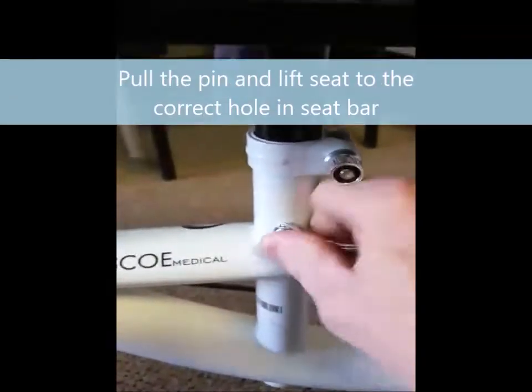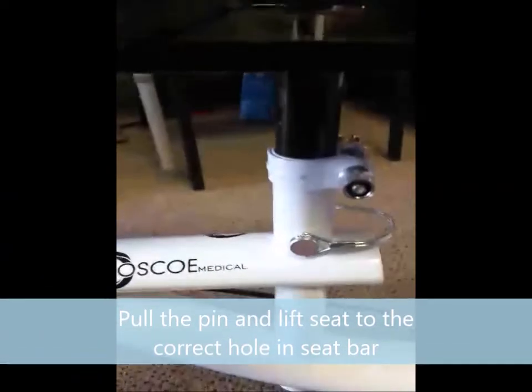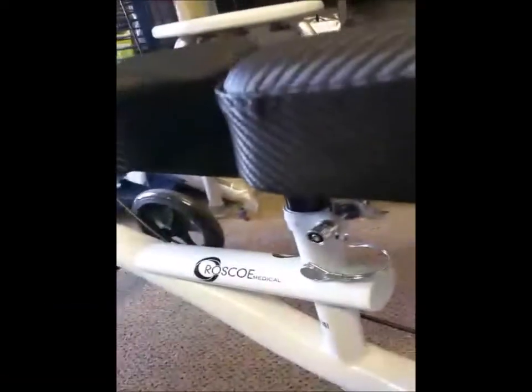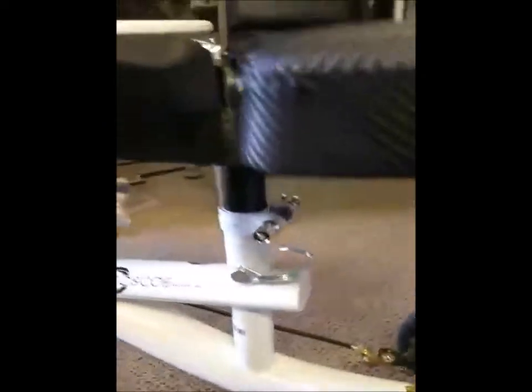The height is based on the shoulders. You want to make sure that when the person is kneeling on the scooter with their shoe on — whatever they normally wear — their shoulders are even, so they're not leaning to either side, which would put pressure on your back.